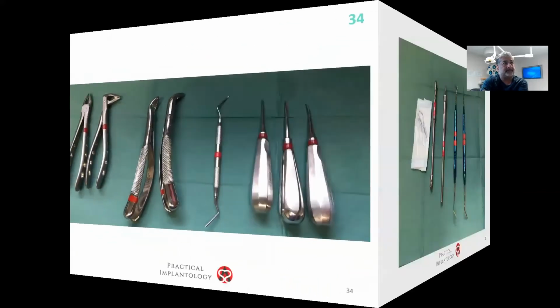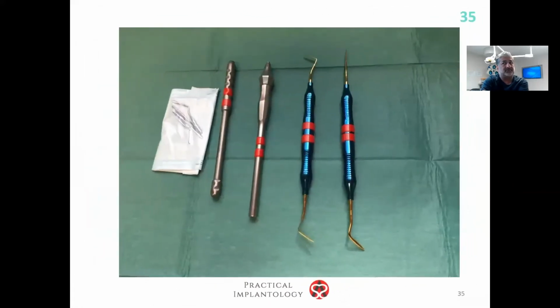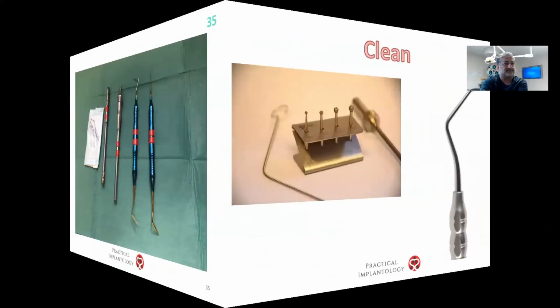These are periotomes. Don't start with these. Forget these. If you progress to implantology, then start to understand how to use these. I don't like using them because they take too long, but they're useful in some cases.